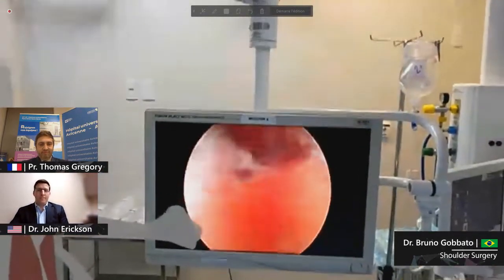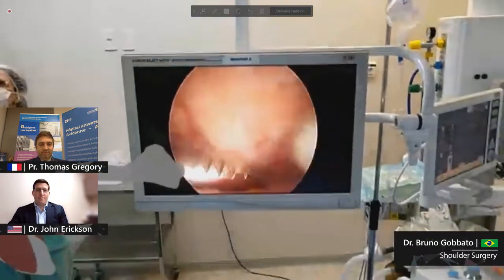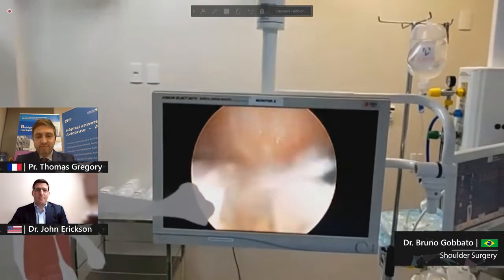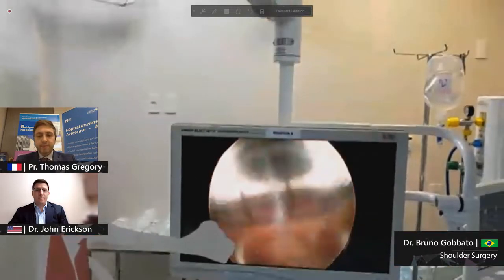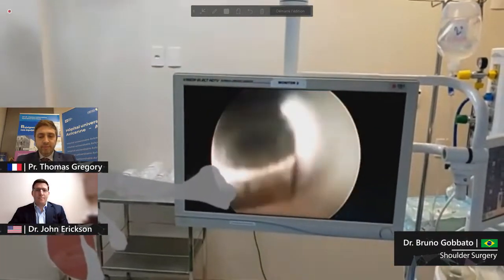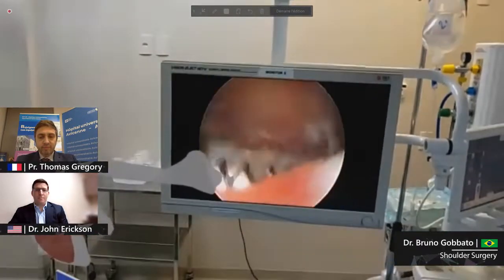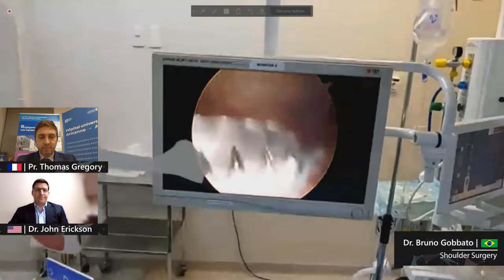And now we are going to do the subacromial space arthroscopy just to make sure everything is okay, the cuff is okay, to remove his bursa. And by doing that, we did a diagnostic arthroscopy. We have the plate removal. Let's check if we have some problems with the screws here, but I don't think we will have. And we are done for today.